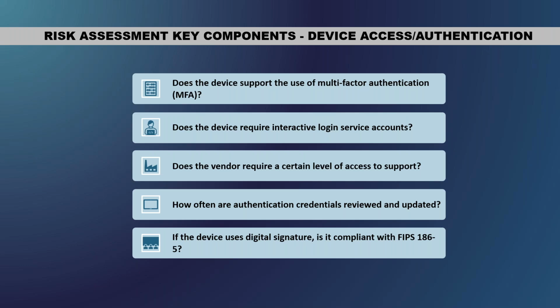Do they have an interactive login, which is what I was asking. The vendor, what kind of access does the vendor support? And how often are they monitoring who has access from their side? So for example, if you have a big piece of equipment like Philips or imaging, obviously they're going to have service accounts, right? You need to make sure that they're managing their employees on their end because they are going to be passwords. They're not multi-factor authentication with imaging pieces of equipment.